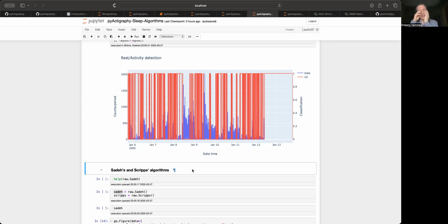The problem is that this kind of graphical interface needs some time to dedicate, and maybe some a priori knowledge that I don't have, or someone willing to learn. But that would be extremely useful to have. It's a project on its own, but it would be extremely valuable. I agree. So you can do it manually at the moment, but maybe we need other tools to do it in a more pleasant way.